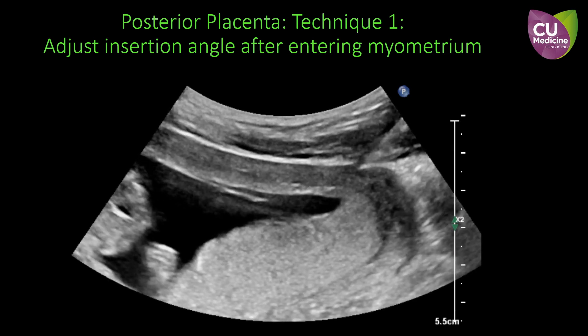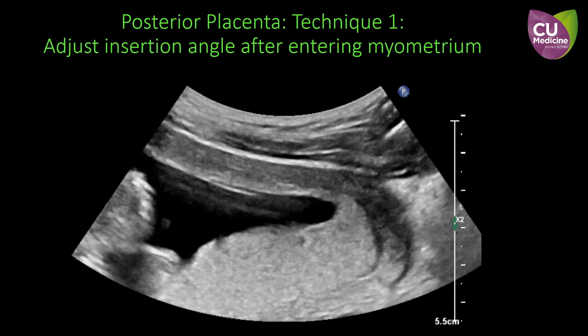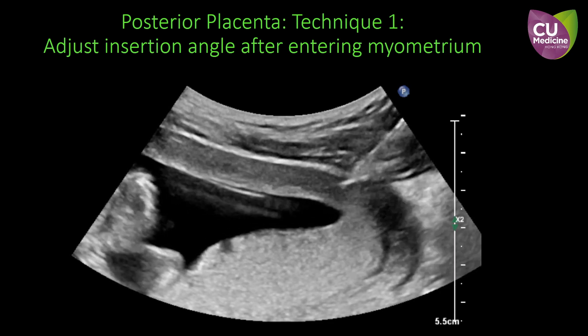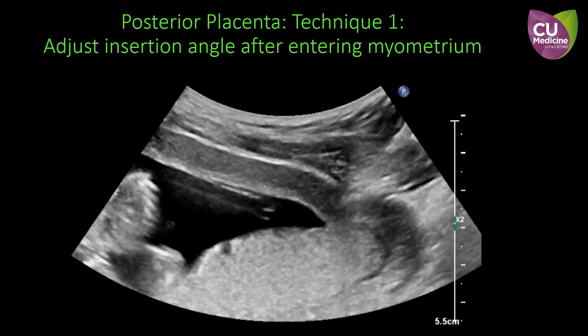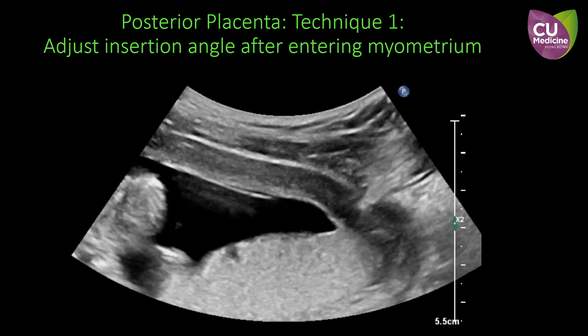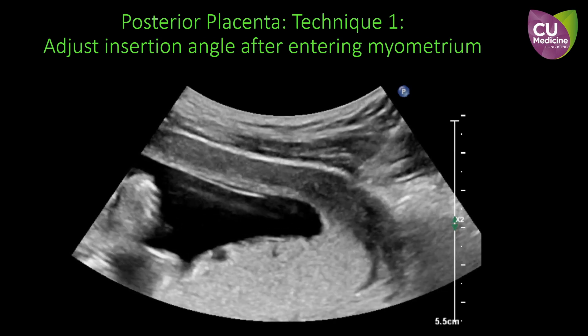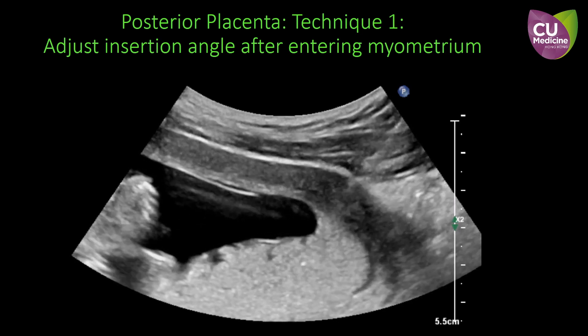Firstly, inject the local anesthetics to the abdominal wall. Insert the CVS needle into the myometrium, carefully avoiding puncturing the bowel or overshooting into the amniotic cavity. Afterwards, tilt the needle more vertically so that the needle tip is directed towards the posterior placenta.